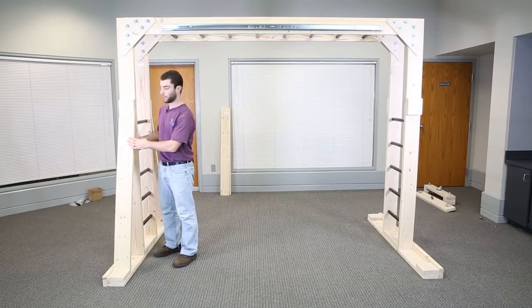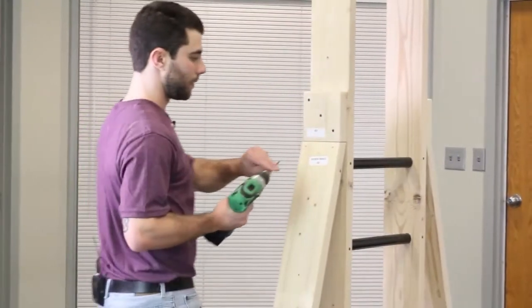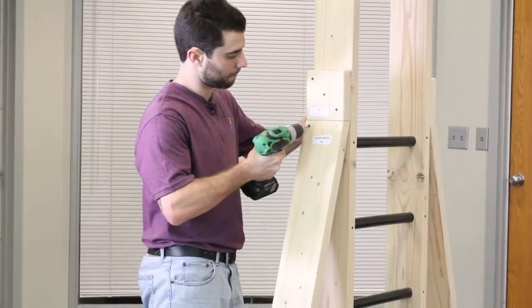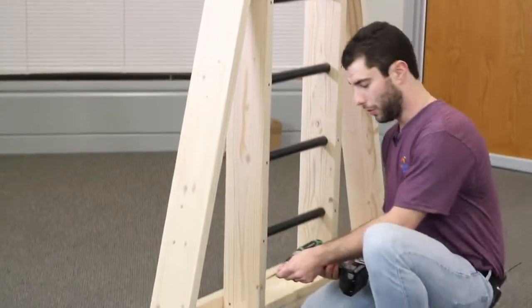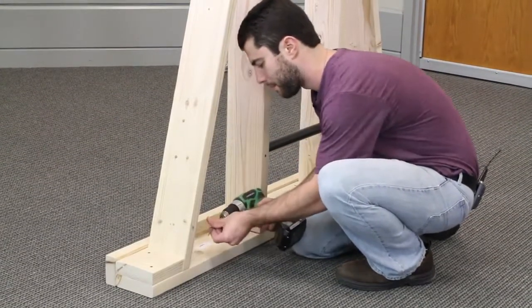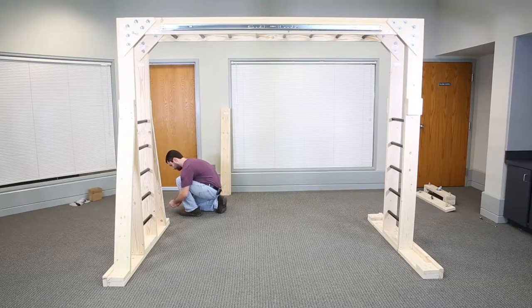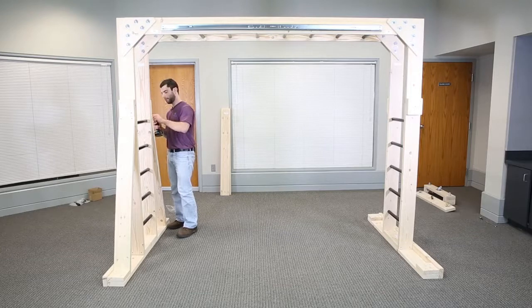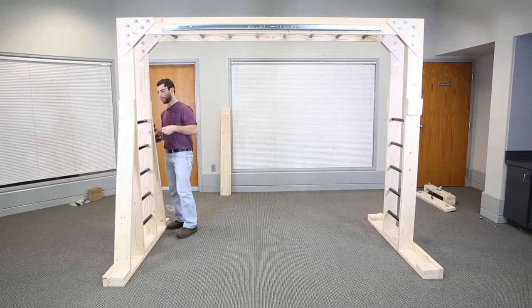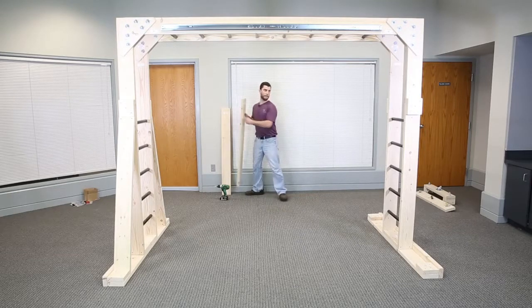Once the kicker braces are in place, you can insert the screws. You'll notice that the kicker braces line up roughly flush with the ladder and the block at the base. Each kicker brace takes 4 screws, 2 at the top, and 2 at the bottom. Again, following the pre-drilled holes. The other side. Once the kicker braces on this side are secure, you can do the other side, just repeating the steps.